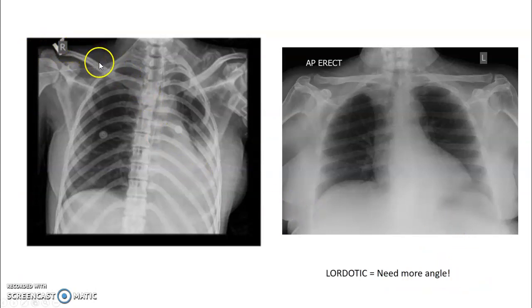For tube angle, ideally you want it around the third or fourth rib and you want to see the apices clear of the clavicles. This is what insufficient tube angle looks like — we call it a lordotic chest — where the clavicles are overriding the apices.